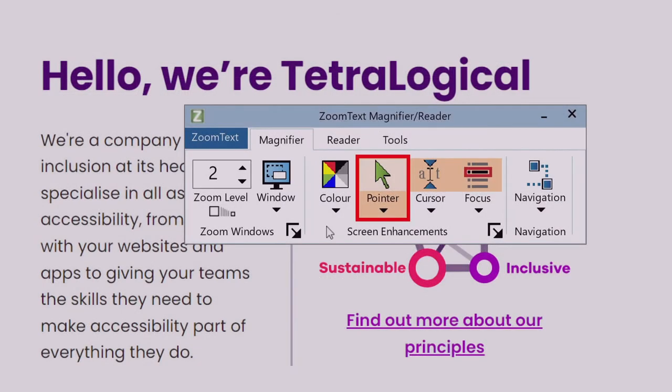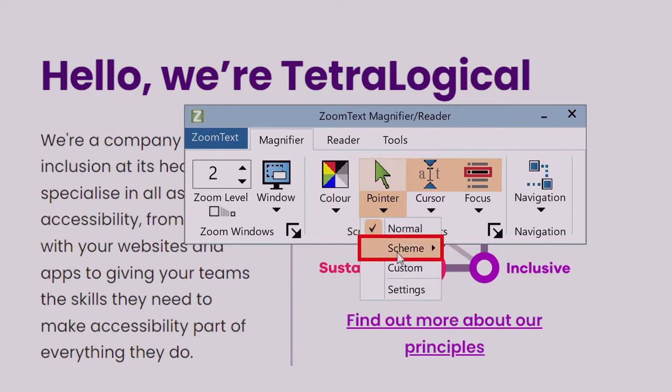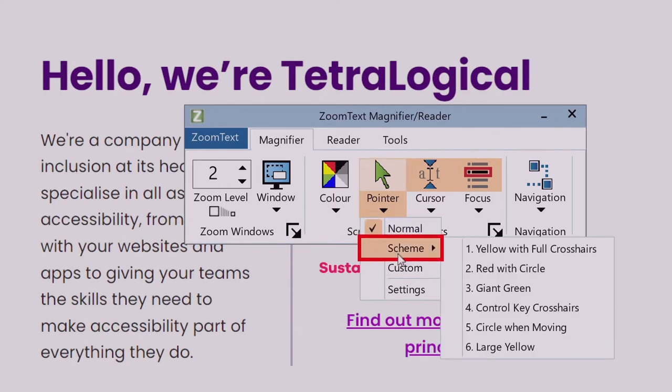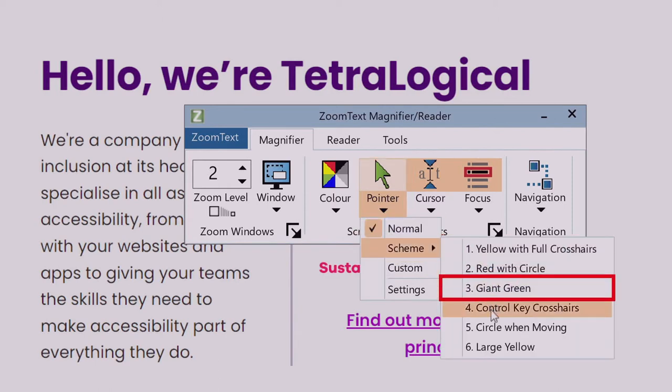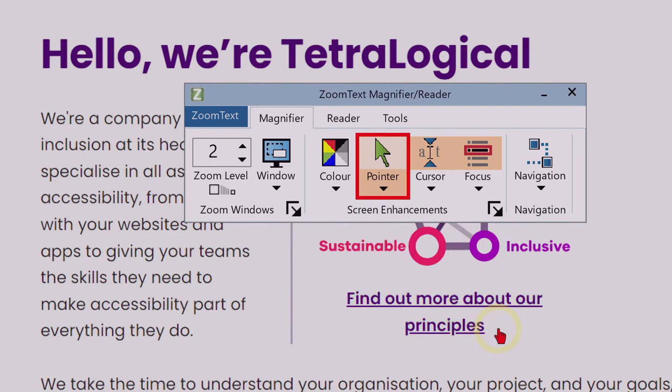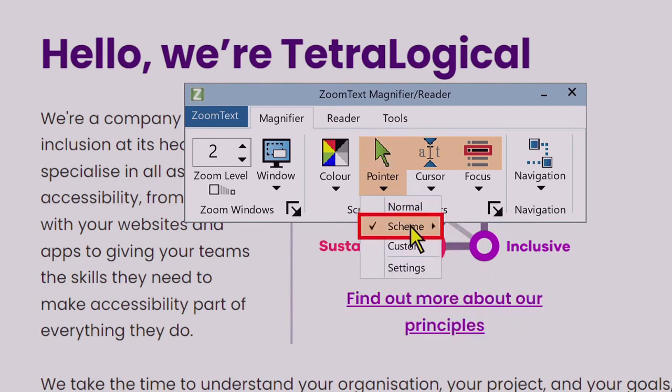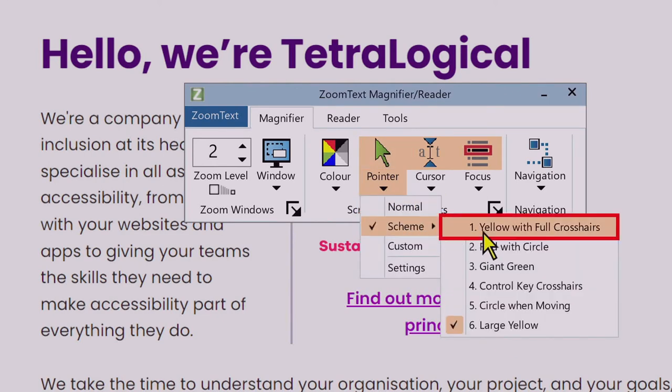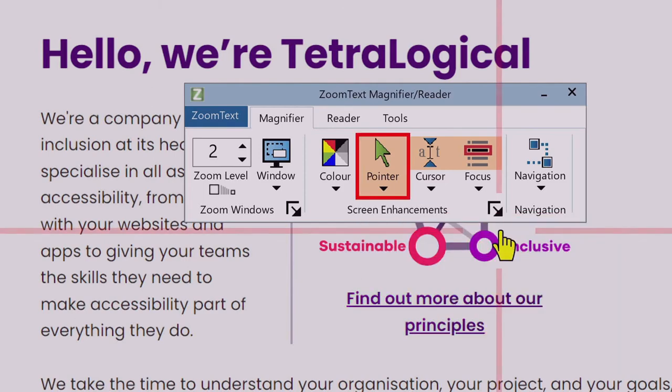Mouse and text cursors can often be modified to make them easier to locate on screen. This could be by enlarging them, circling them, or changing the color. Some people may prefer to use crosshairs rather than a mouse cursor, especially if they can be customized.